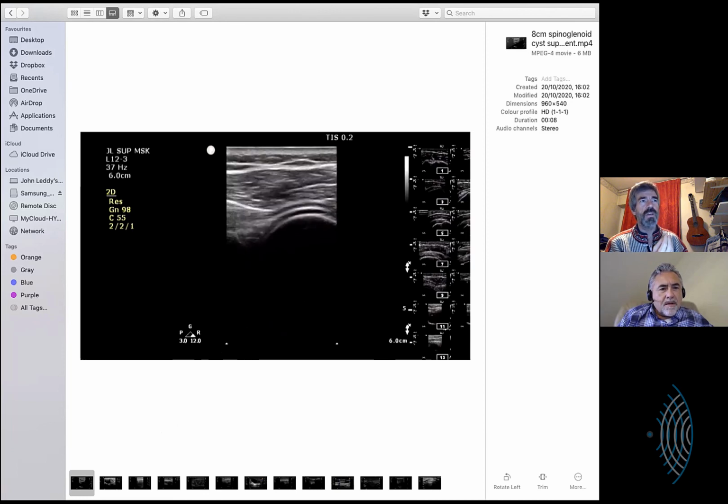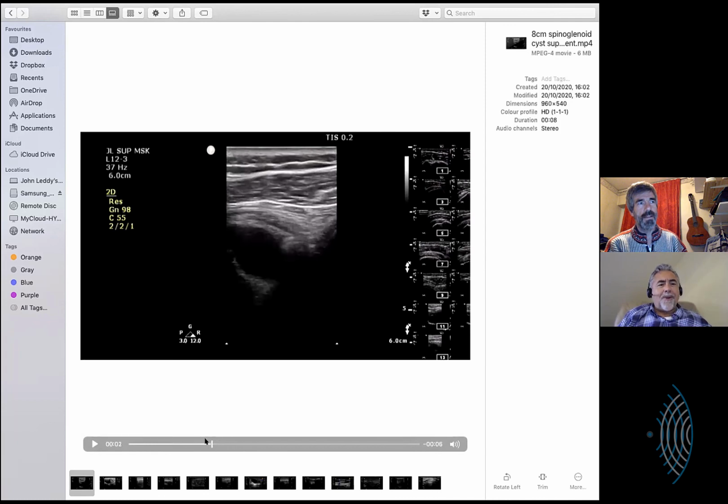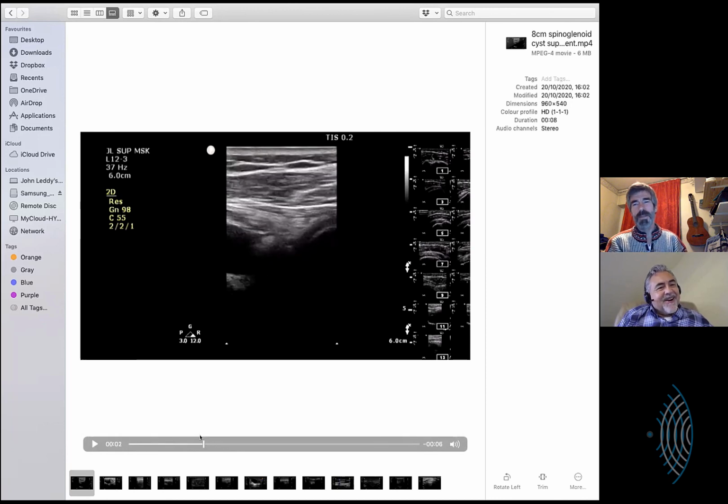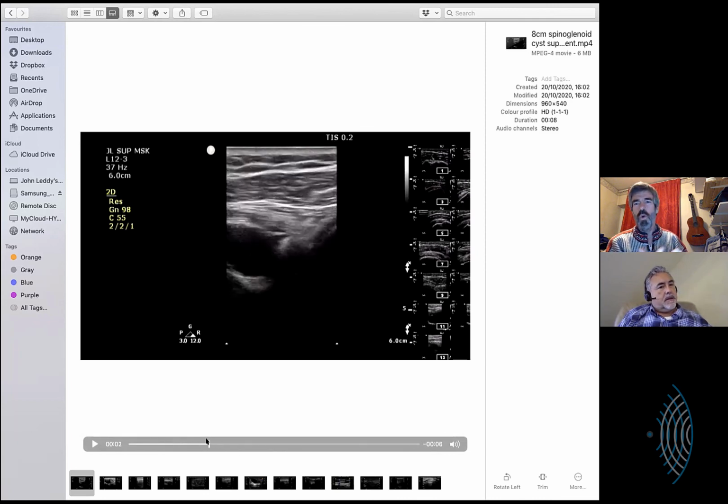And then I go back and I look at my normal view for looking at the back of the joint, and this is what I'd taken. Yeah. So the posterior view of the joint. Yes. And then I actually did my job properly, and I went sideways. Oh my goodness! So that's just on the other side of the glenoid. Yeah. And this one extends all the way up under the supraspinatus, and then all the way back in the infraspinatus. And I very nearly missed it.